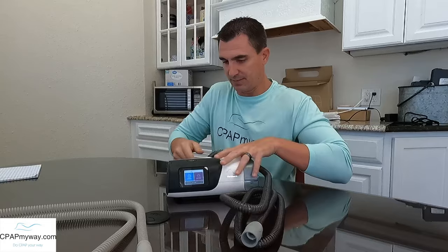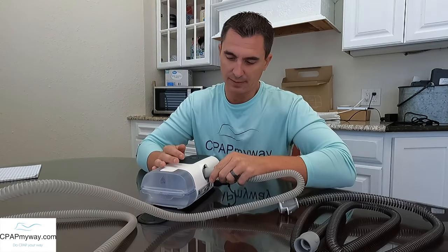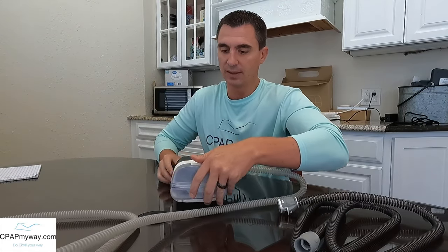So if you're considering going without heated tubing, it is really simple to try it. The only thing you have to do is pull the heated tube off of your machine. On the AirSense 11 here, just give it a little pinch and pull, and then just hook up a standard tube. The machine itself will change the settings inside — your humidity settings — from the heated tube options to the standard tube options on its own once you remove it. So there's nothing really to change on any of these models.